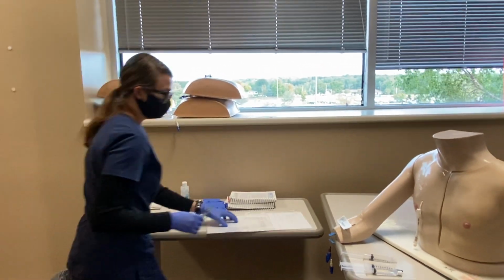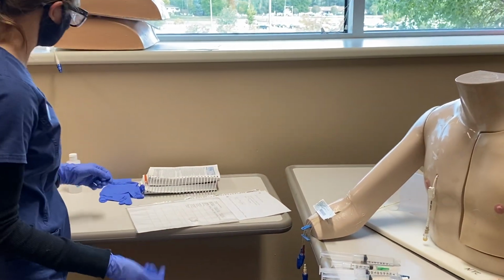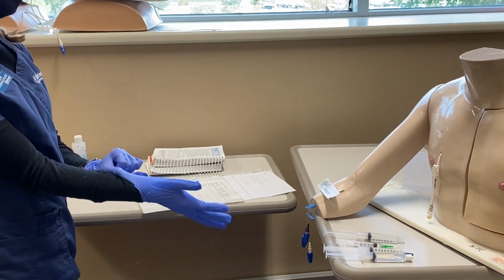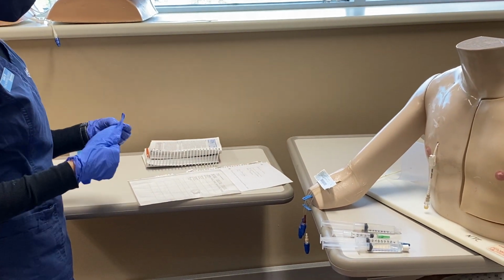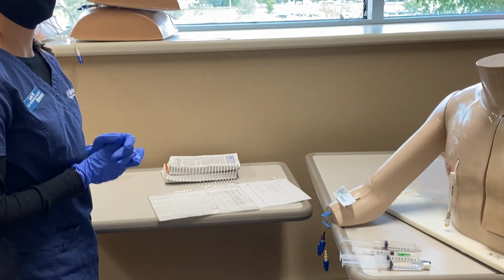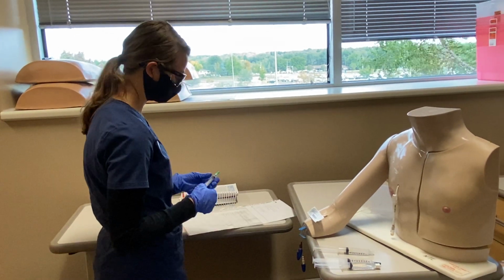Alright. So, Mr. Owens, I need you to keep your arms still. Are you able to keep your arms still and follow my commands today? He says he is. Had this been a child, I would have to have an adult in here or a second person to help me.